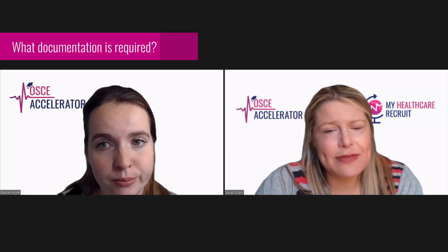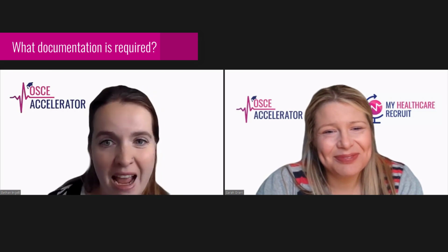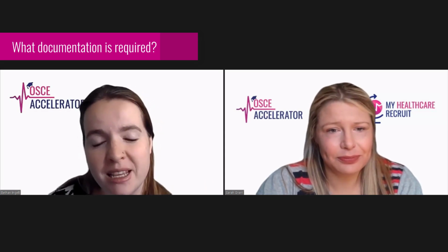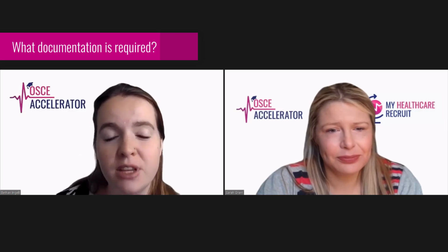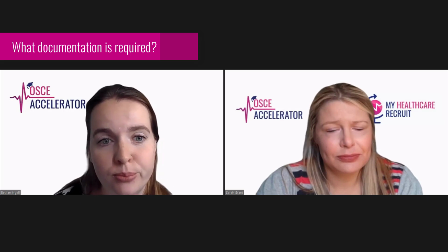Got you. Is there any documentation required for this station? You're not actually required to complete any documentation, which is a plus, because it's only 8 minutes. They will give you an introduction paper, which will tell you how much water is in the balloon. It should be the standard 10 mils. If they don't give you that paper, you can just ask the examiner how much water is in the balloon.